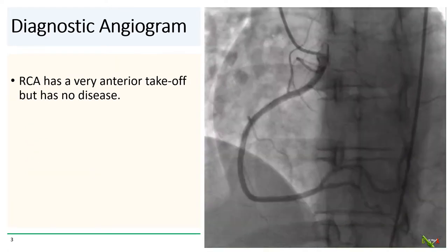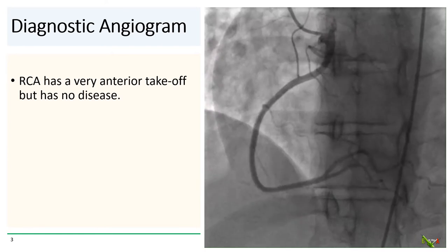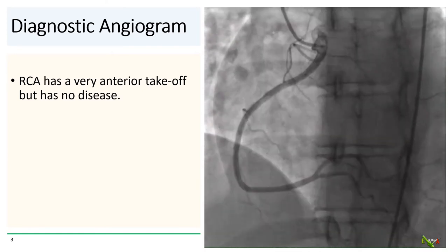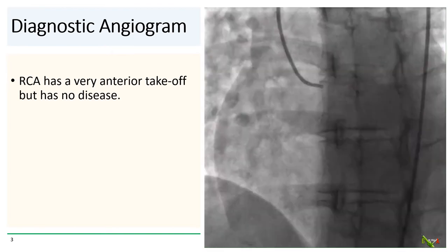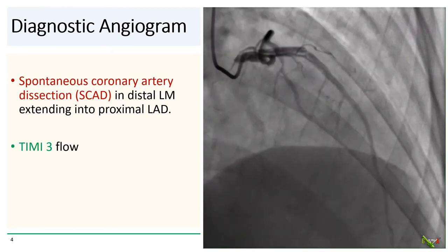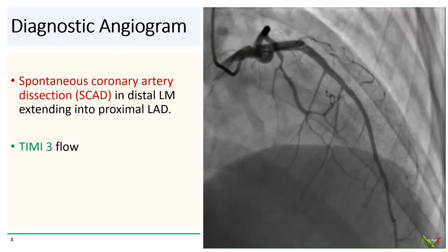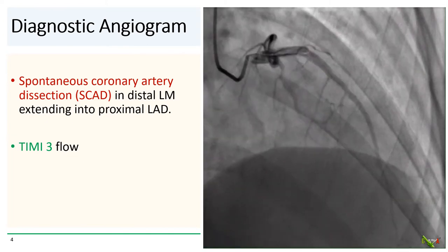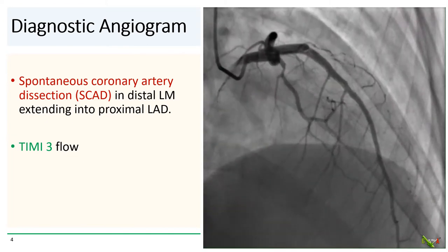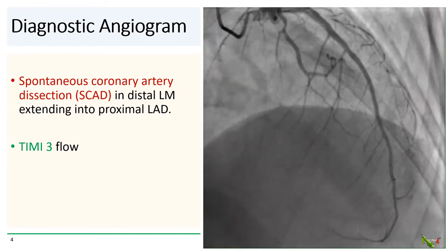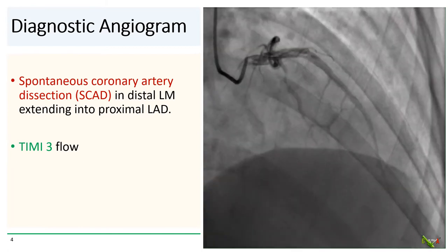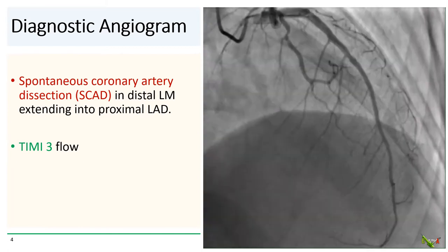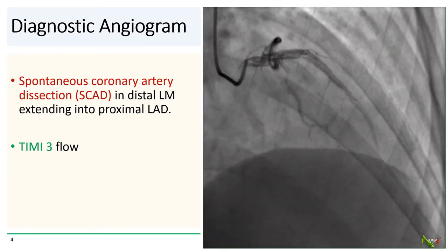On diagnostic angiogram, the RCA had a very anterior takeoff but has no disease. Looking at the left side now, we can clearly see a white line extending from the distal left main into the LAD. This white line is the dissection flap that separates the true lumen from the false lumen.